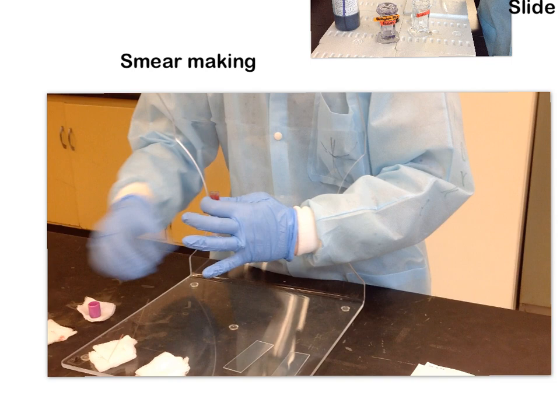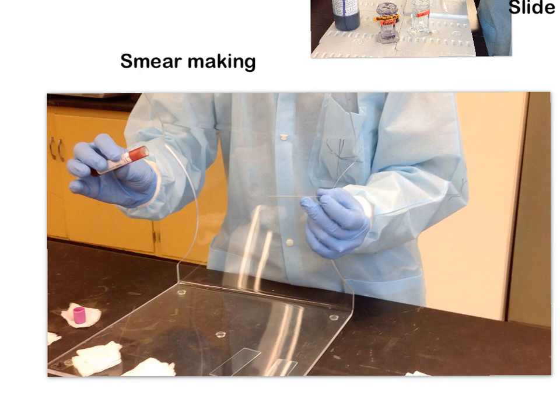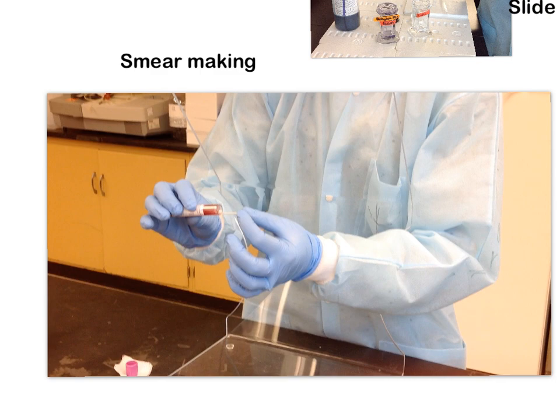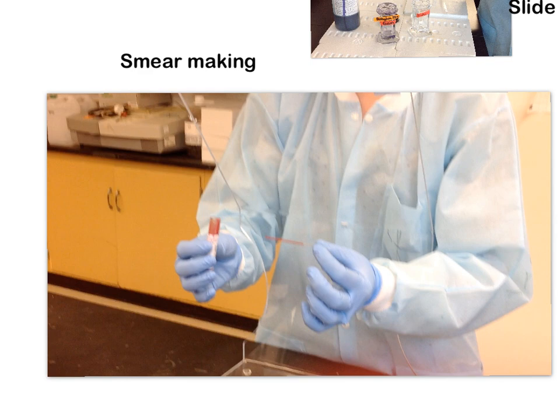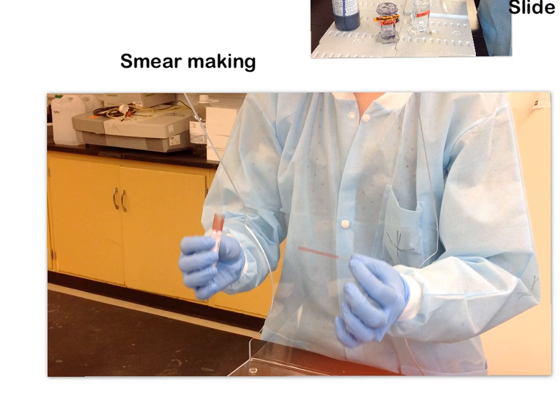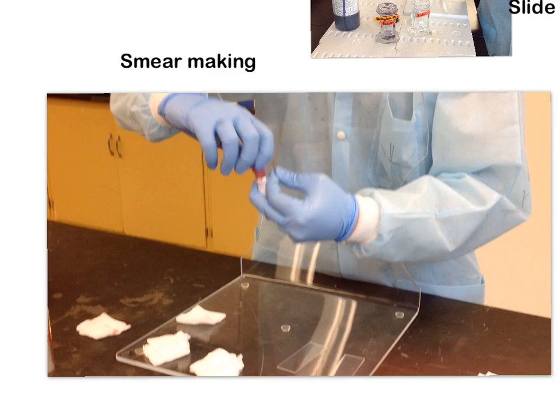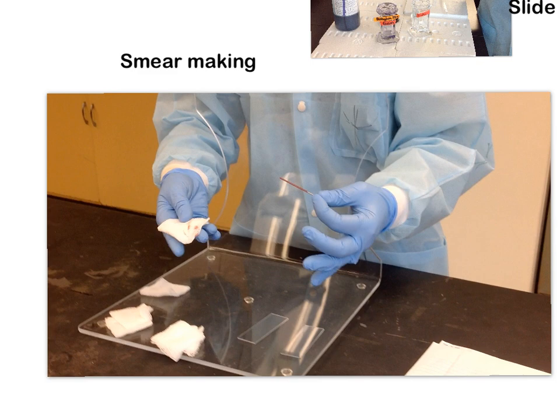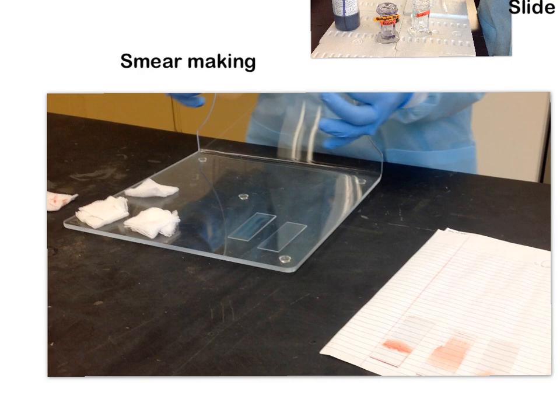Grab your capillary tube. You're going to hold your tube of blood pretty much sideways — don't panic, you're not dumping it. Hold both the tube and the capillary tube horizontally and stick the capillary tube in; you'll see blood flowing into it. If you try to do this vertically, it will not work. Recap your tube, make sure it's tight, put it back on the rocker, then gently wipe down the capillary tube to remove excess blood from the outside. Now you're ready to start making smears.